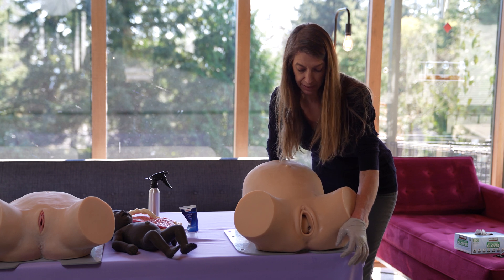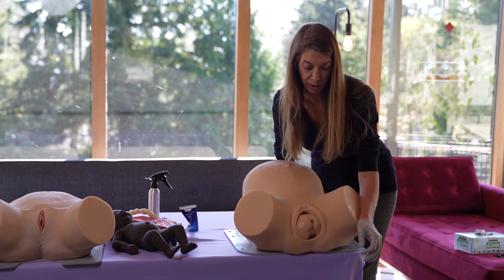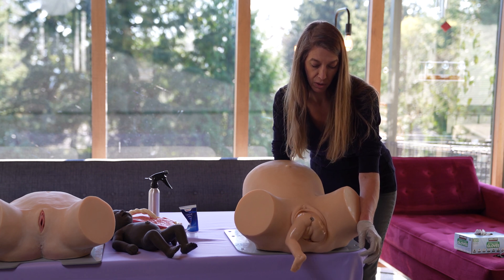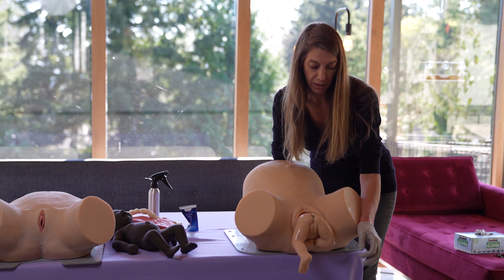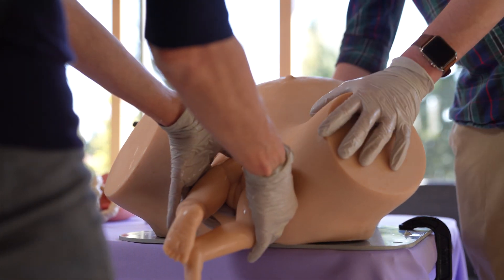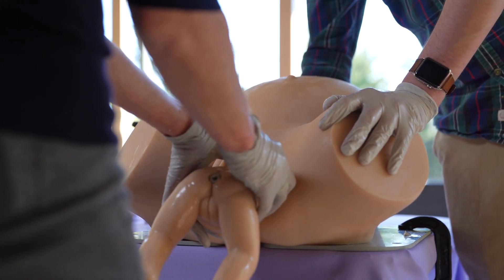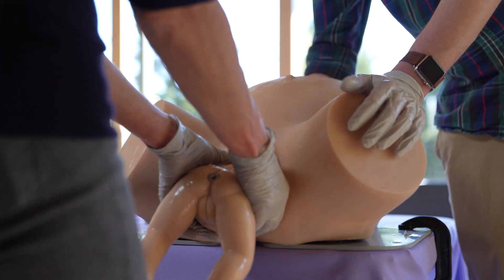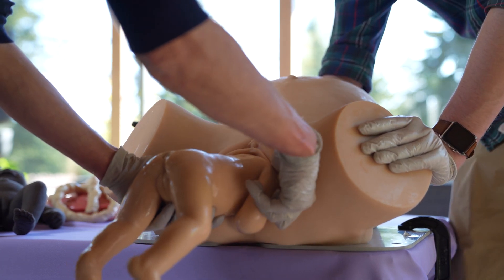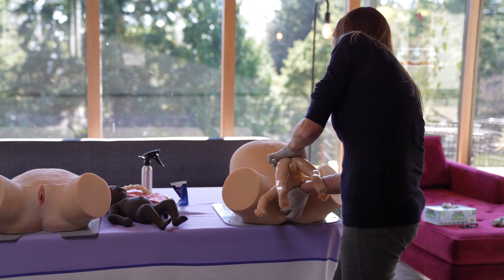Once she's inserted, I use a bit of pressure on the base to give myself some leverage, then give it a bit of muscle to the point where the rump is coming — and now I'm not needing to exert much pressure. I'm just slowly letting her deliver. Hands off a breech, so baby's legs are coming. At this point if you're going to have a towel involved you can do that. You can also do maneuvers to retrieve the arm, then insert the hands, and usually with two people, up she comes.